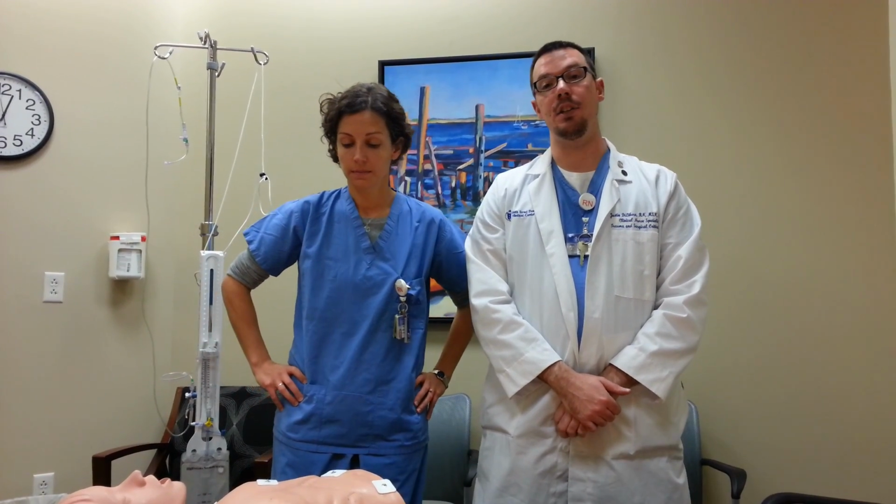And we're going to talk with you today about ventriculostomies and lumbar drains, which you will see in the operating room, in the ICUs, specifically the surgical and trauma surgical ICUs, and in neuroprocedural areas. And there are some specific safety considerations that you want to be aware of. So these devices are used in patients generally with high ICPs. They allow us to both monitor ICPs and they allow for drainage of CSF, which helps us to manage ICPs.